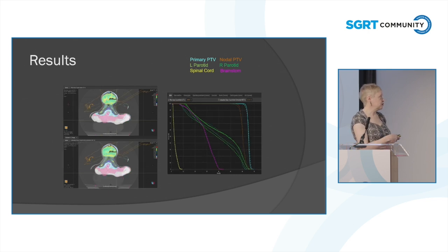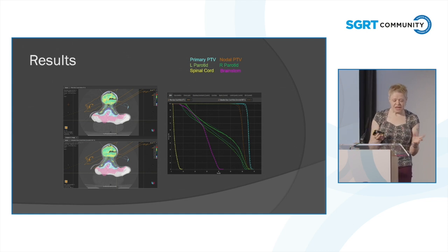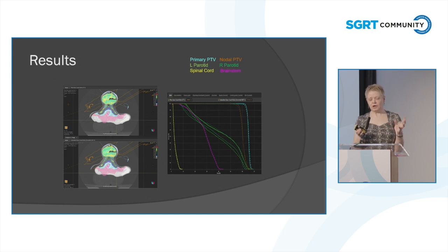And we also found that on the couch kicks, in the way the patient was actually treated, again, there was hardly any difference in the cone beam and the actual planned treatment. This was sort of a bit of a disappointment because I was hoping that avoiding the shoulders would make a huge difference, but we rationalised it that we hadn't made it worse. We'd delivered good treatment. The patient actually had reliable treatment on set. It didn't take any longer to plan, and we were now going to go ahead with the retrospective study to see whether this class solution that I'd come up with for this patient would actually work.